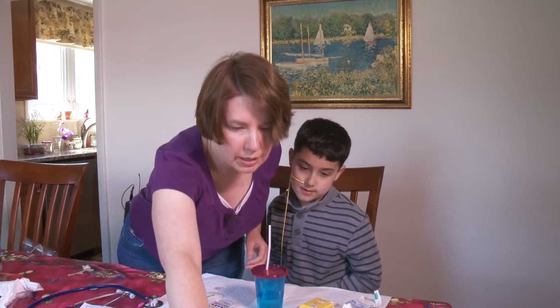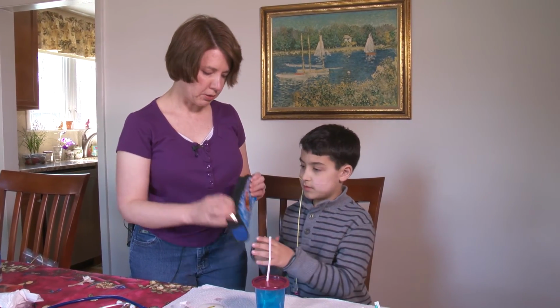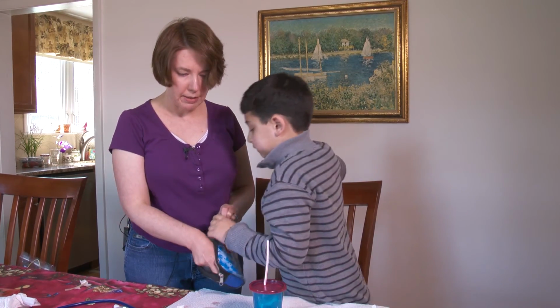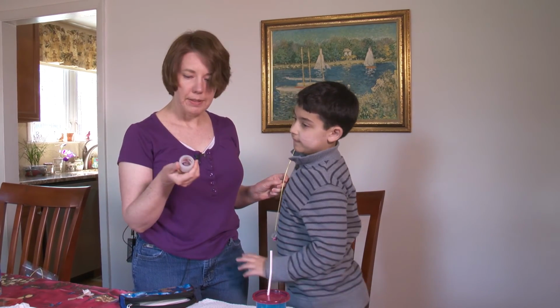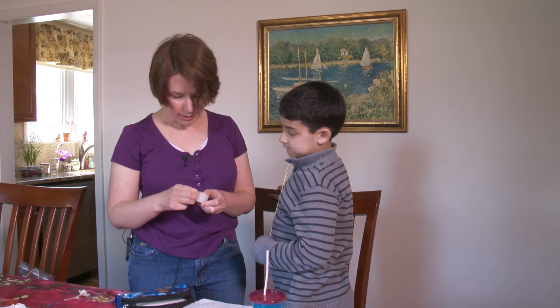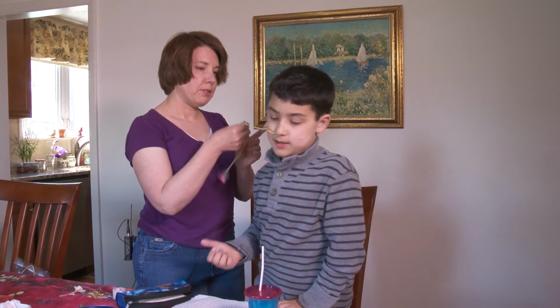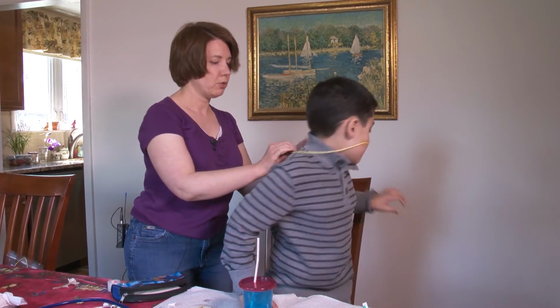I have also made a little kit so that when the tape falls off for whatever reason, we have a syringe and some spare tape and some tape for his back, which is actually what we need more. The silk tape works really well for this, but we usually just take a piece of tape and tape his tube to his opposite shoulder back here.